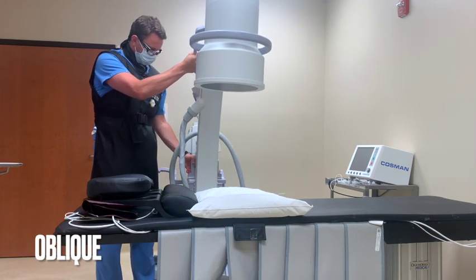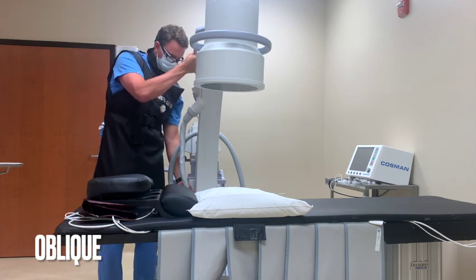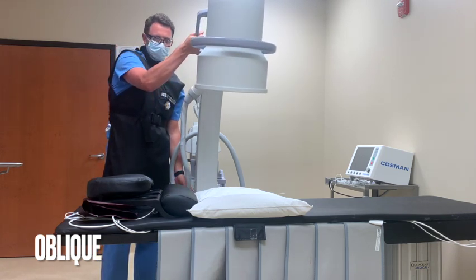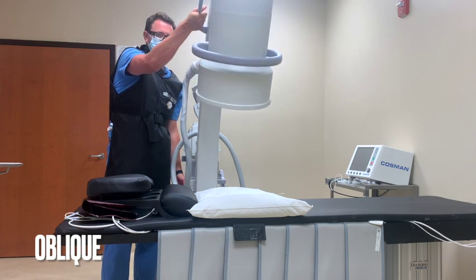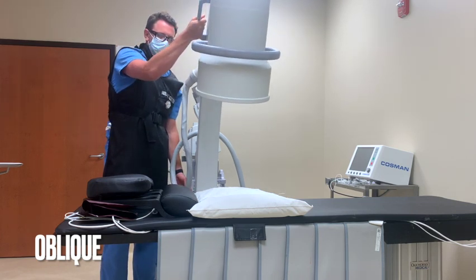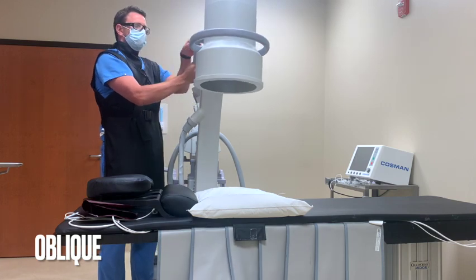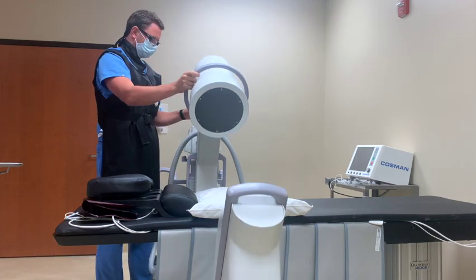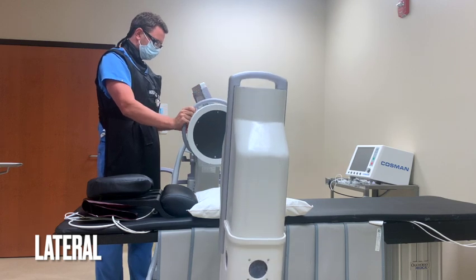We will now display the oblique movement. The C-arm rotates circumferentially around the patient either towards or away from the physician. The lateral position refers to 90 degrees oblique.